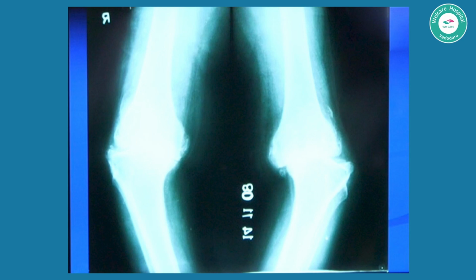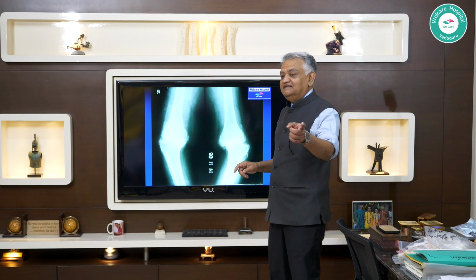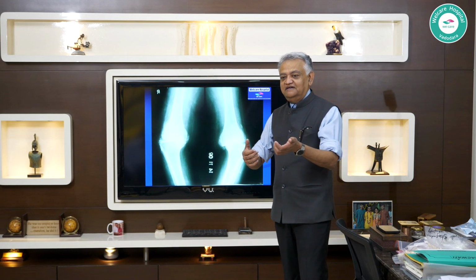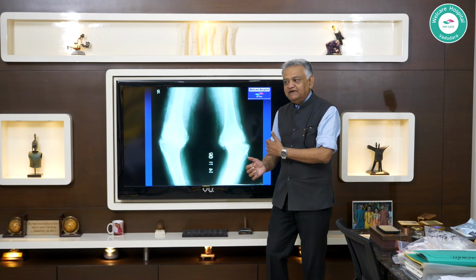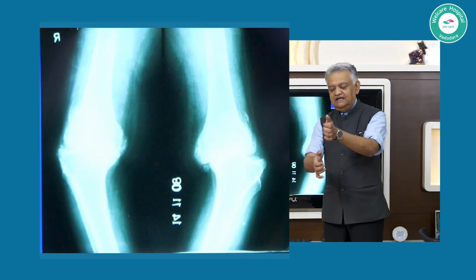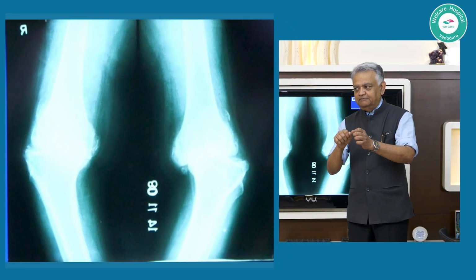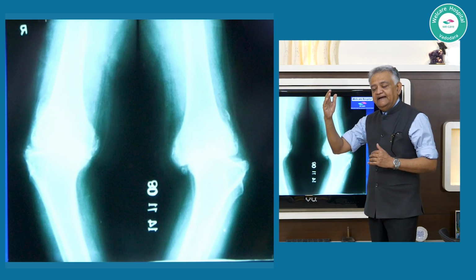Number three, during reduction, I am still sticking only to the subluxation part. During reduction, I think I told you guys, your assistant and your team have to know that they have to press these things into alignment. Otherwise, the insert that you will do will not be that easy an event. And many times, the surgeon not realizing why his insert is not sitting on his modular tibial tray will keep on hammering, whereas all that is required is for the team assistants to align the femur and tibia. And once that happens, the spine and the cam mechanism then captures it, and then later adaptive soft tissue changes do the job.